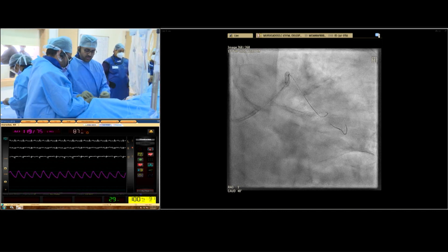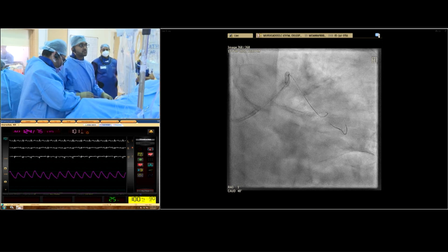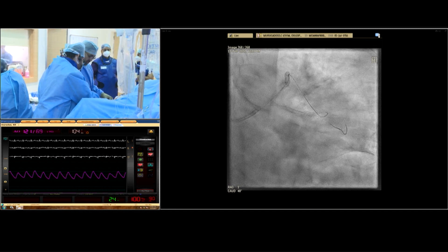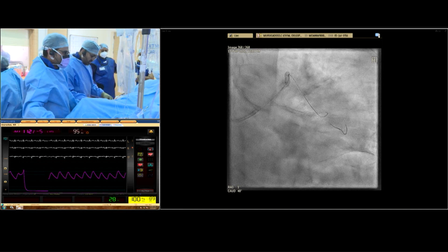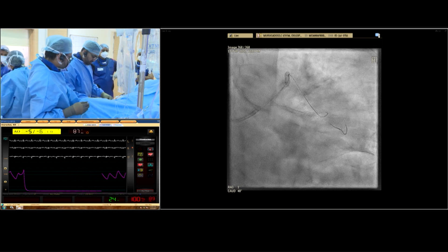That's a very good suggestion. We start with 7. Bigger the better, absolutely. It's always difficult to change after. The pressures are okay, and from the head end of the patient, he's okay. Dr. Swapna and Dr. Smyrna are happy, so I'm happy.